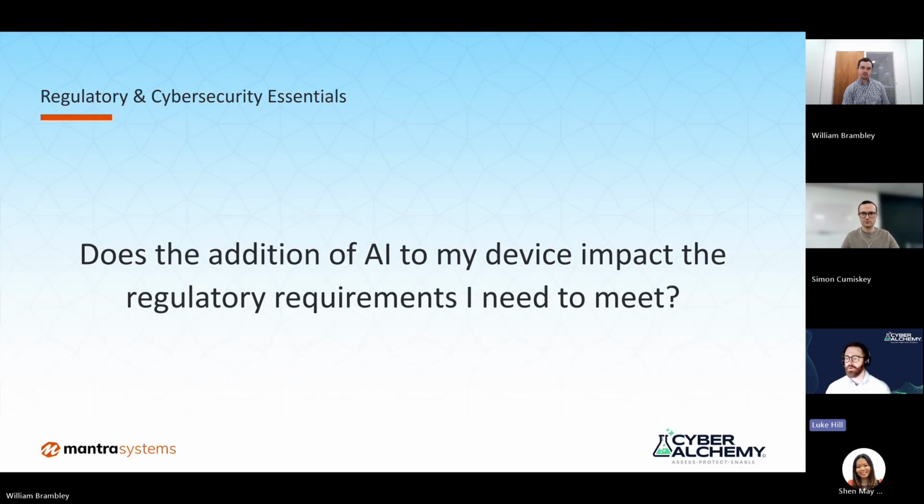But if you were to self-host a model, then you've got to build a lot of security around that as well. So the attacks like prompt injection, which I gave a bit of an example of earlier with the Scribe, or like model theft and stuff like that, that can become a real worry for you, because if you have developed your own model, you will have spent quite a lot of money probably in developing that model, and so that should be treated as highly sensitive intellectual property. Also, if you can then work back from the model to pull data back out, depending on what it is that you're classifying, if that can then be turned back into PHI or personal identifiable information or anything like that, then that's also going to be a bit of a problem from a compliance standpoint as well.